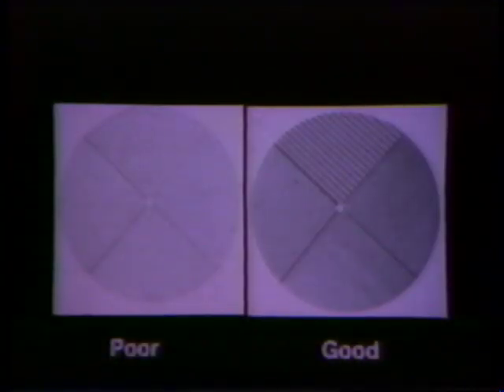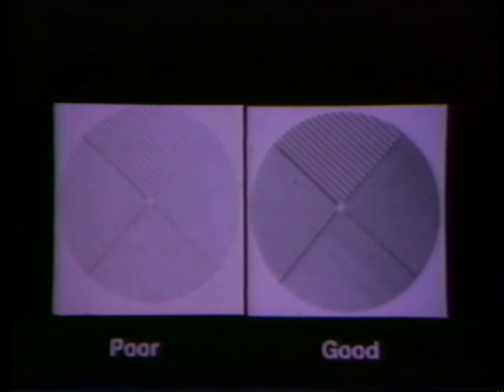Since the image is made up of hundreds of thousands of dots, each representing a single photon striking the crystal, the operator must tell the camera how many dots to put on the film to create the image. This number is a function of the desired image resolution, the length of time available for imaging, the type of study being performed, and the number of events emitted from the patient per second.